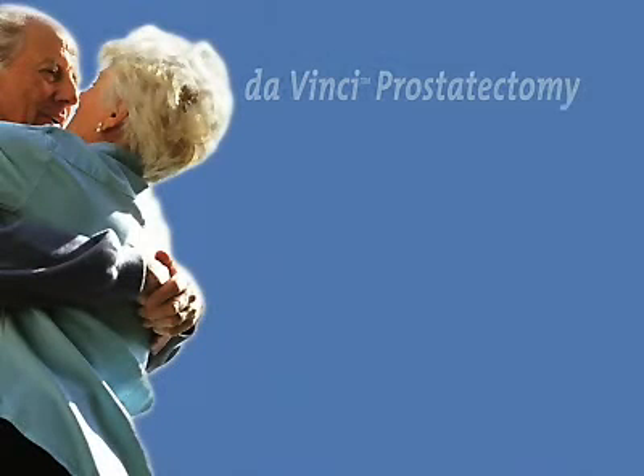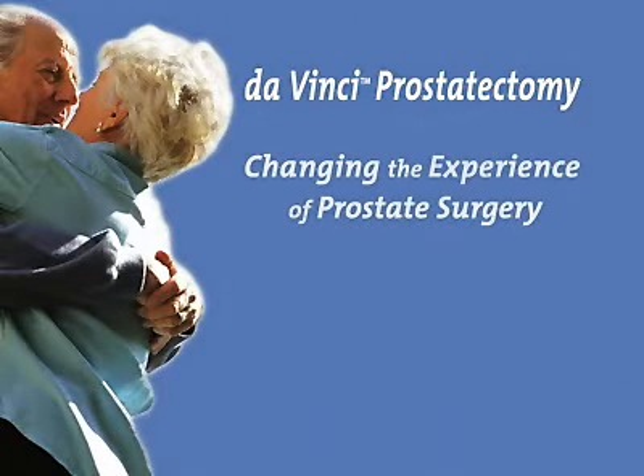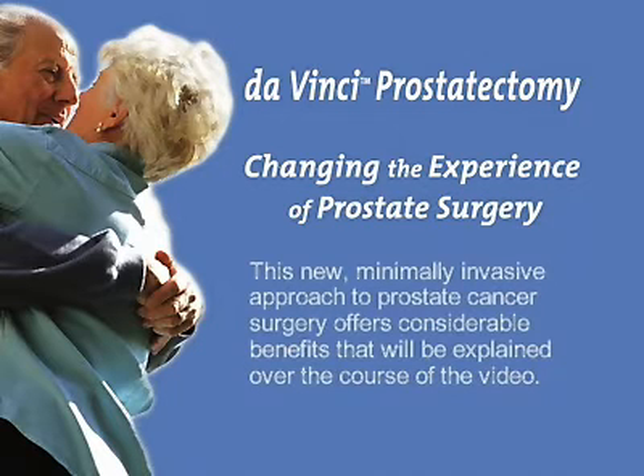This program provides an overview of the da Vinci prostatectomy procedure. This new, minimally invasive approach to prostate cancer surgery offers considerable benefits that will be explained over the course of the video.